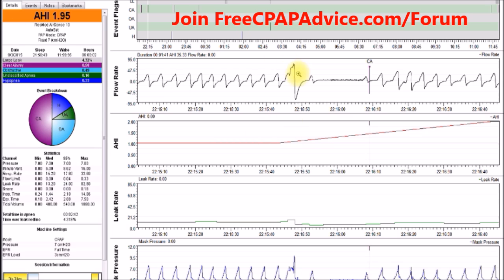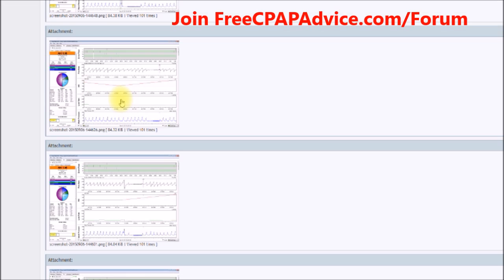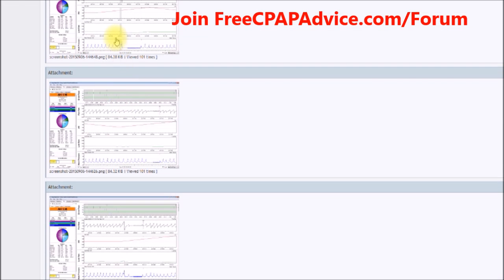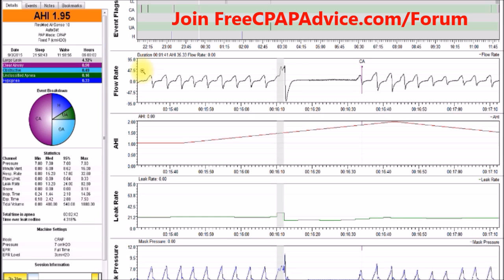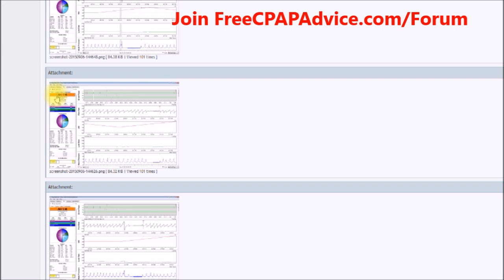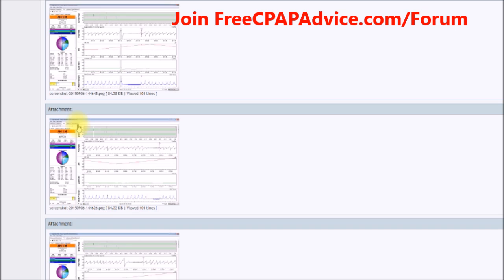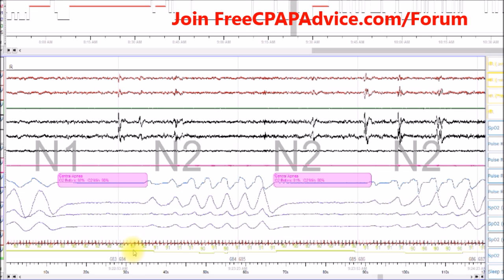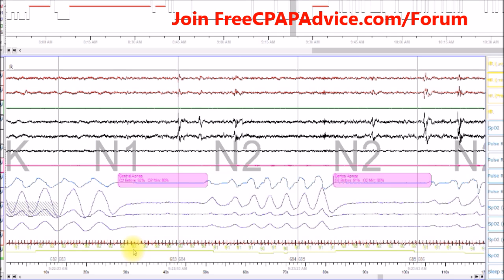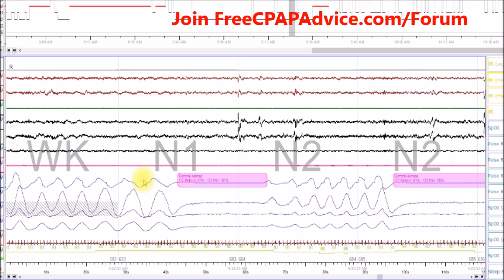Here's another one - same thing: spike, then central apnea. And another one: spike, central apnea. Those are not real central sleep apneas.